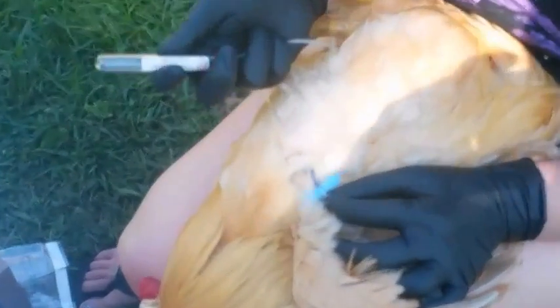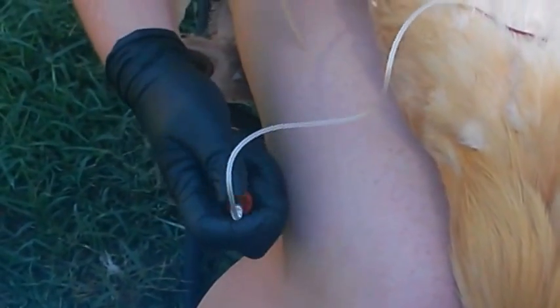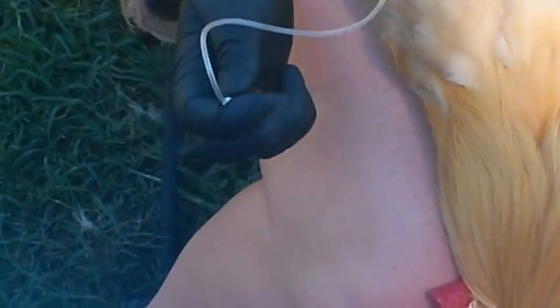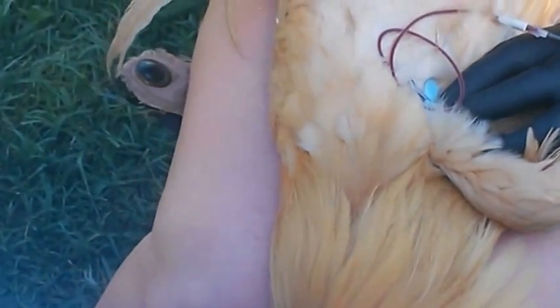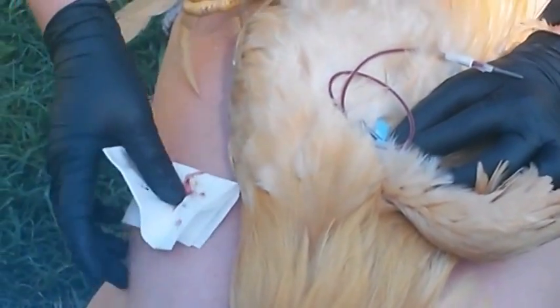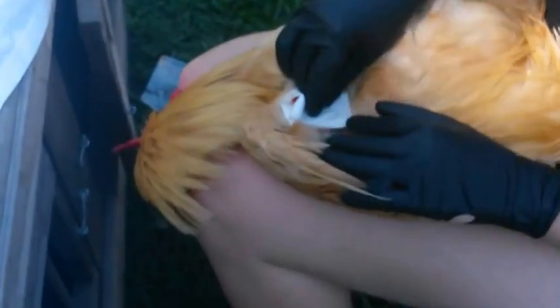And as you can see I got blood into the tube, and I'll just pick it up. You need about one cc of blood — right about there, that's plenty. Those are four cc tubes. Now that you've gotten your blood drawn from your bird, pull this off — this is no longer any good. One time use only.